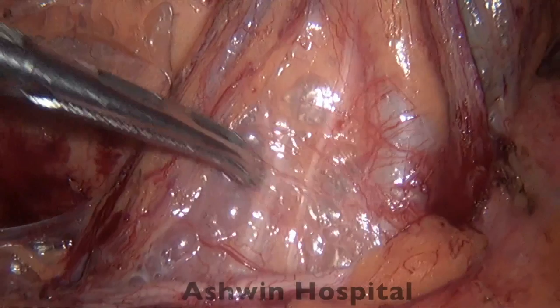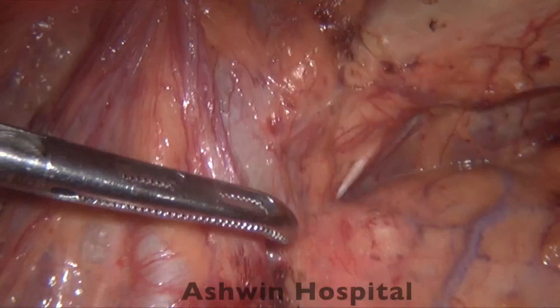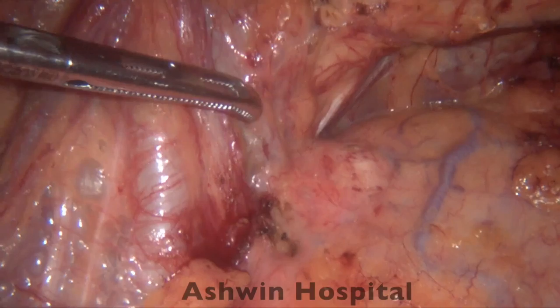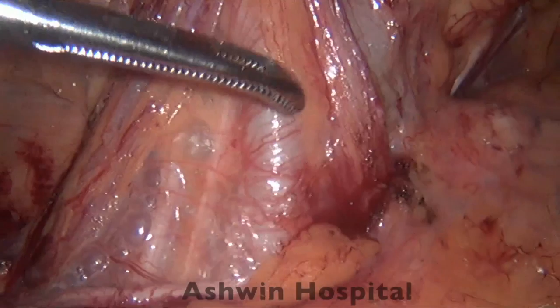That's the external iliac artery. You can see the external iliac vein which is collapsed because of the pneumo. That is the obturator nerve, a white shiny structure which we are seeing now. So this is the dissected space and a complete parietalization done. That is the vas which is forming the medial border, and the testicular vessels which form the lateral border of the triangle of doom. So that is the artery which is present in the triangle of doom.